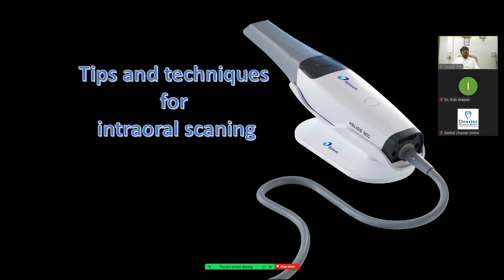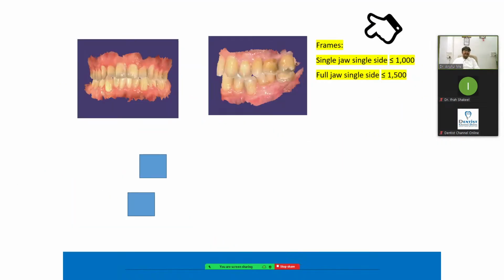So now I should start my journey to the digital level, like from this to this, how you can start your digital journey. If you start the journey for the prosthetic part, the first thing you require is scanning. If you scan the case, then you can enter the digital era. So the first part is scanning. If I ask how many have a scanner, maybe 50% of the doctors will say yes, we have a scanner. But if I ask what is the life of your scanner, out of that 50%, not even 5% know the life of the scanner.